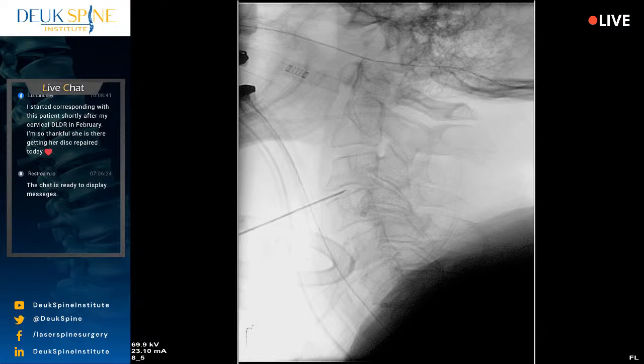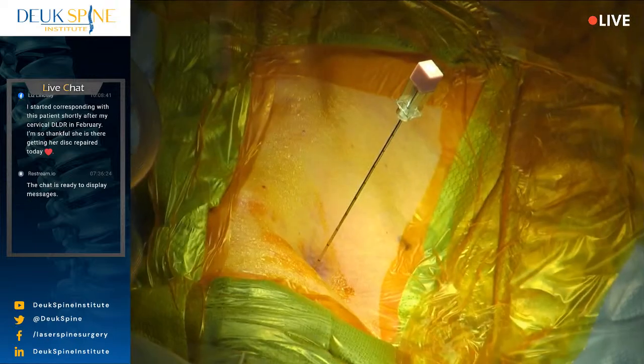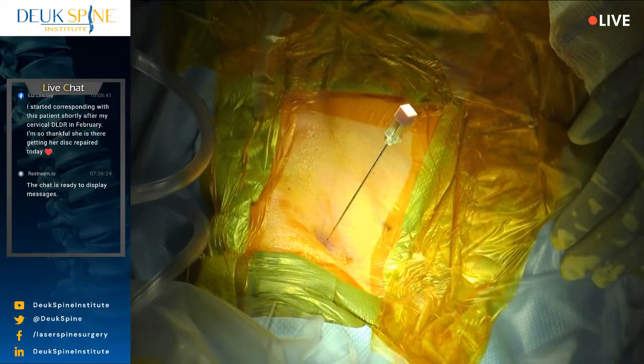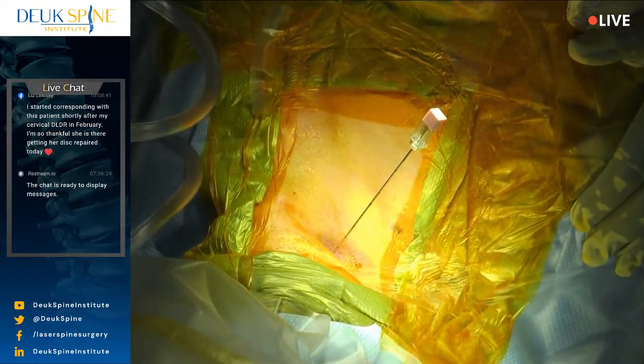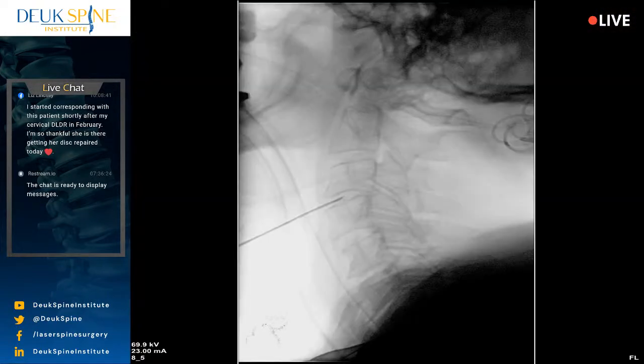All right, so what's going on down there at 6-7? We're going to need a little bit of shoulder pull. You're going to have to help me, okay? So you're going to take the shoulder and the ball, and you're going to feel it with your fingertips. You feel that? Yes, sir. And you're going to just gently pull it south. Okay. Not much, just a little bit. We pull his head in inline traction. And let's just get a quick shot and see where we are. Shot. All right, so 2, 3, 4, 5, 6, 7.